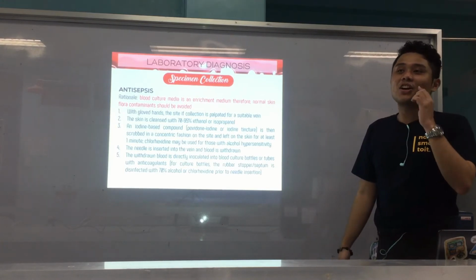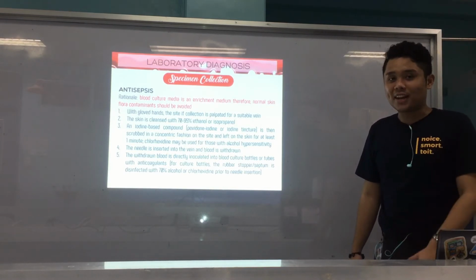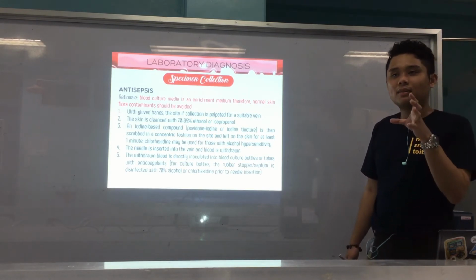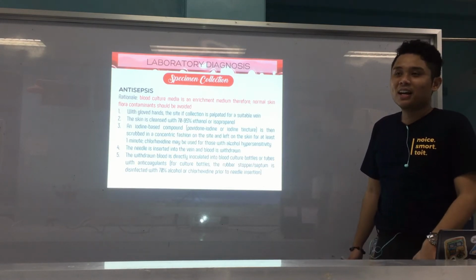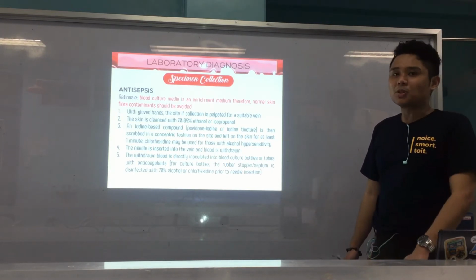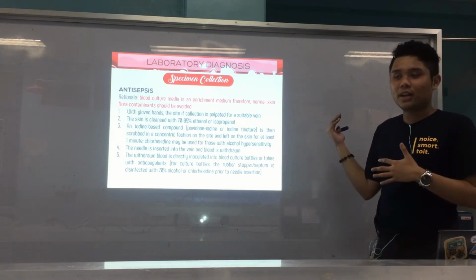Because again, your blood will clot, okay? And what happens is if muklat ang blood, that could trap the bacteria na present sa imong blood. So if nanay clot na mahitabo, ma-trap ang bacteria dito, so therefore wala na tayo ma-isolate. Okay? So dili na ito makita ng pathogen, di na ito ma-identify kung unsay cause sa disease or sa sepsis sa imong patient, di ba? So, as much as possible, mabutang dayon imong blood into the blood culture bottle, okay? Katong later akong i-show and atong i-discuss.